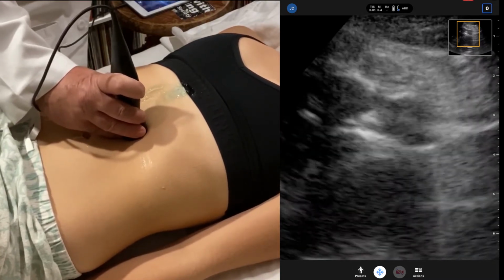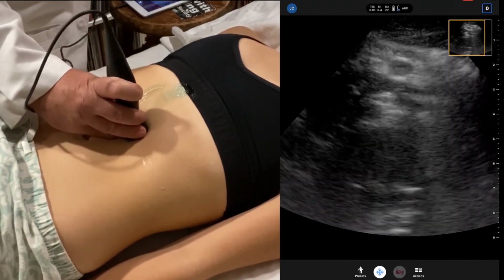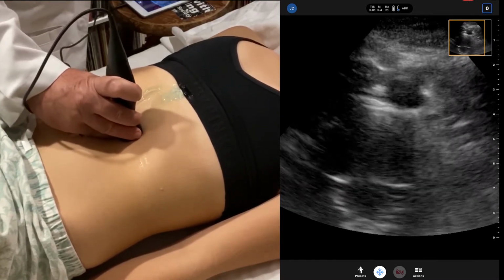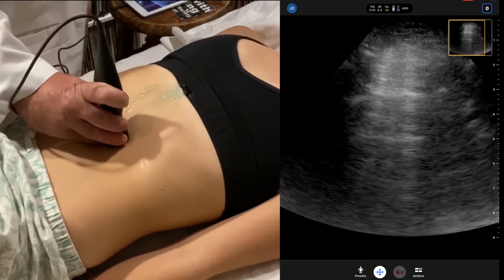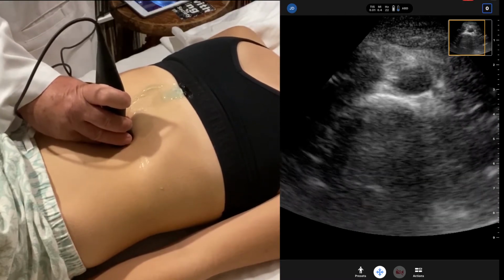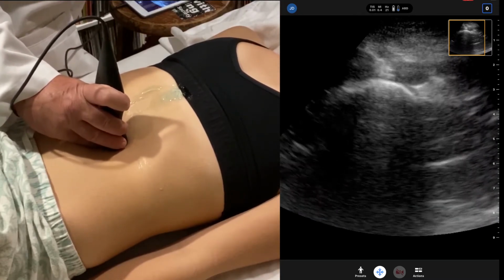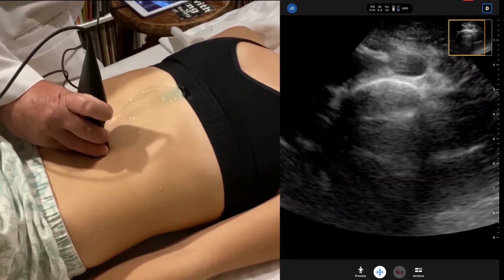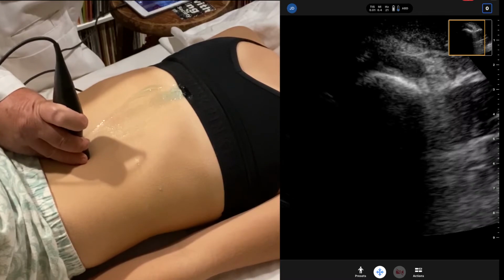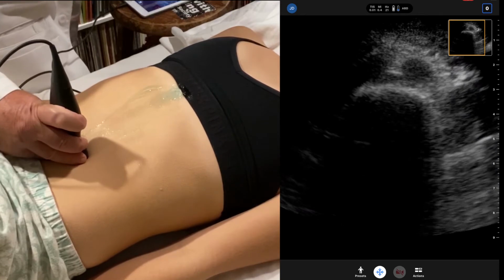And we're going to go back to real time here, back to the aorta. And you can use your functions here. And as we go down, we're moving toward the iliacs. The aorta is now the most superficial here. We'll note the bifurcation of the left and right iliac arteries in real time as we move down. And we see the bifurcation happening here. We see the bifurcation of the aorta right there. Now we have the 2 iliac arteries.